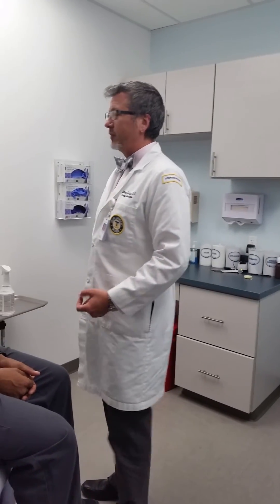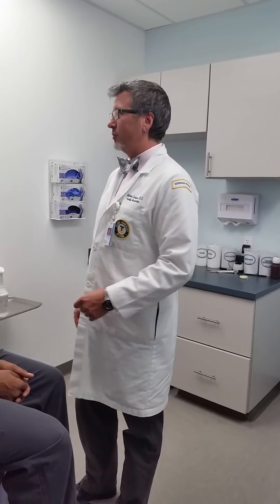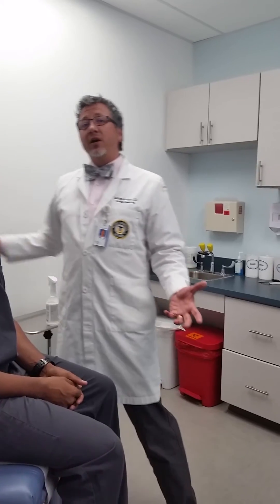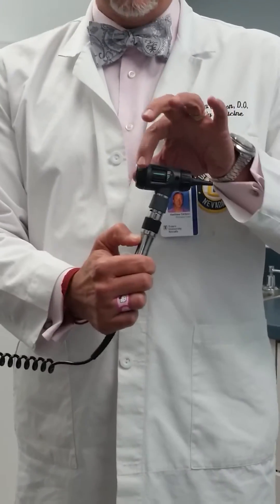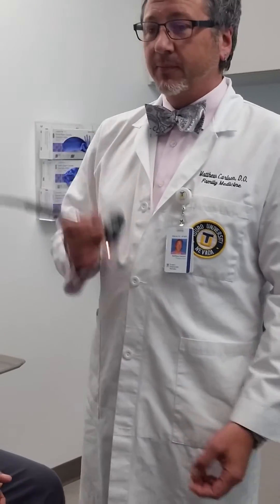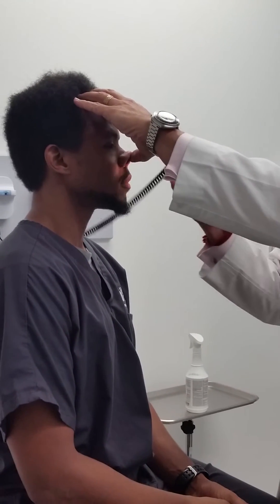For our nasal exam, we've already used the GRIP mnemonic — greeting, establishing rapport, describing our procedure, and providing privacy. I've washed my hands and introduced myself to the patient. I'm going to use my otoscope with the largest ear speculum available. You hold the otoscope like a pencil, gently place your thumb against the patient's nose, and perform the piggy nose maneuver.